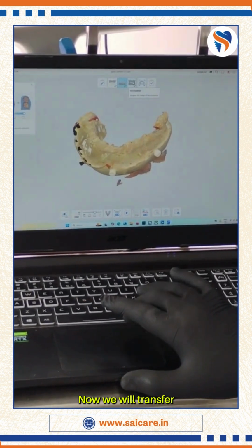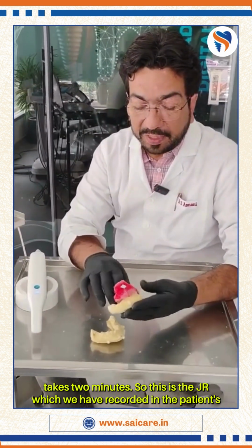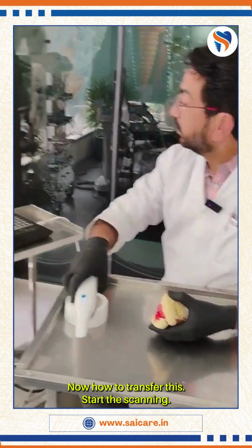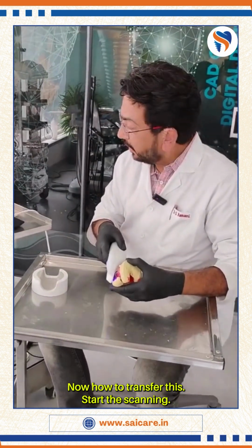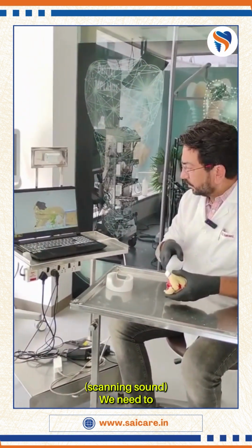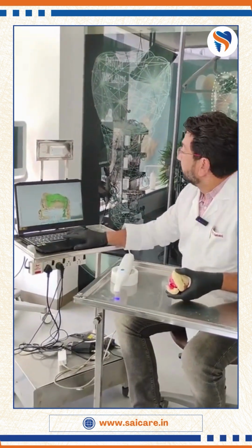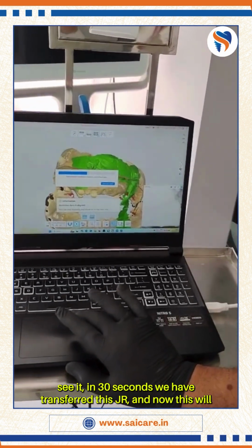Now we will transfer the JR. It hardly takes 2 minutes. So this is the JR which you have recorded in the patient's mouth. Place it on the model. Place the lower cast. So now, how to transfer this? Start the scanning. We need to capture this. See, now the JR is recorded. It hardly takes 30 seconds to transfer this. Once this is done, process it. You can see in 30 seconds we have transferred this JR.